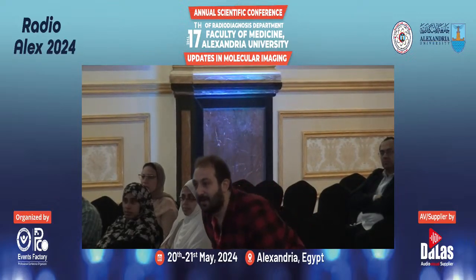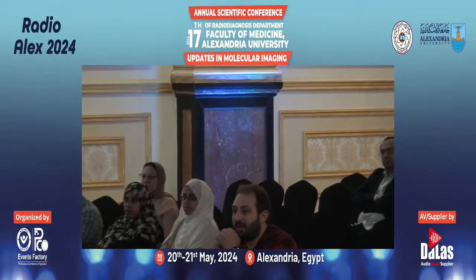So your question is, if you do delayed imaging, do you reduce the urine activity? Is that the question? In 50% of the patients, the urine activity is eliminated or decreased significantly to detect small lesions, and in other patients, urine activity just persists, and I don't know why. Right.